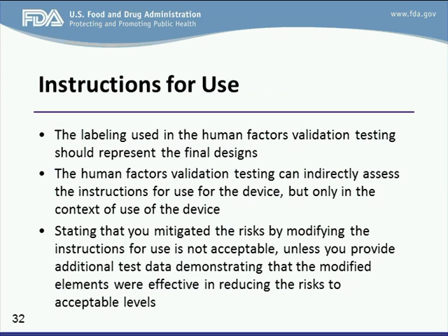In a representative scenario, usually your users will make their choice whether to use the IFU. That means some users may use the IFU during the actual use. Some users may choose not to. The human factors validation testing can include the IFU as part of the setup. However, the test participant should make their own choice whether they use IFU during the testing or not.